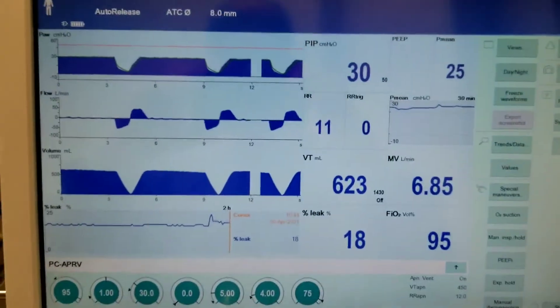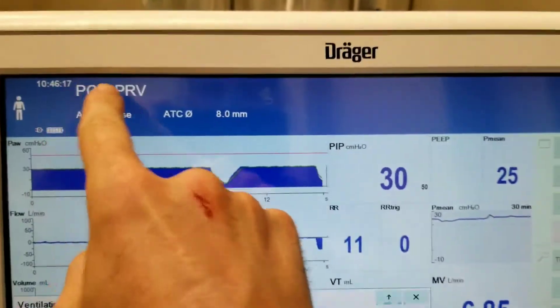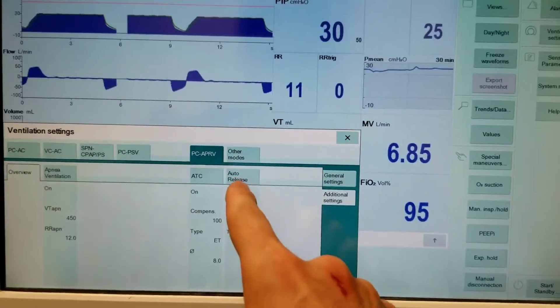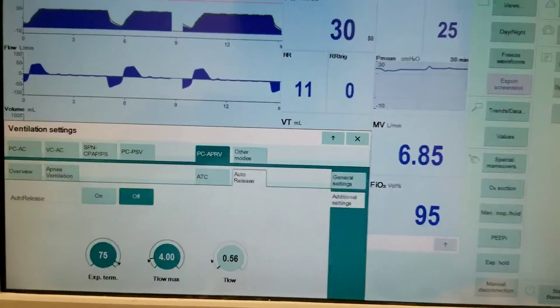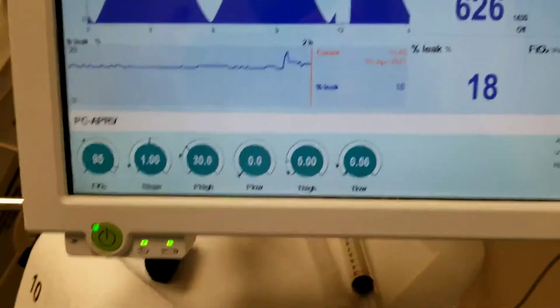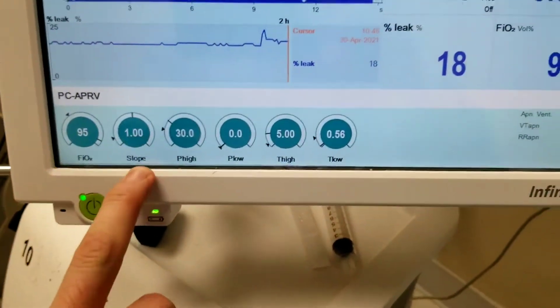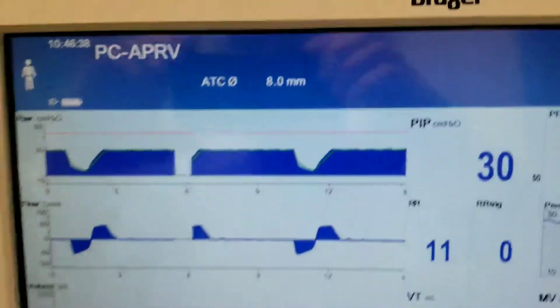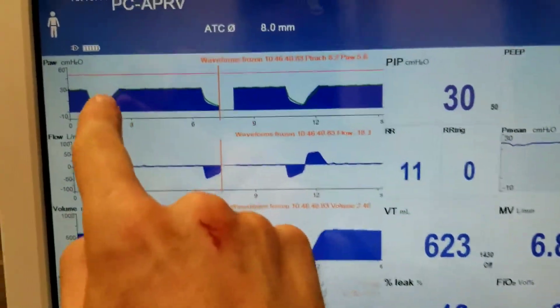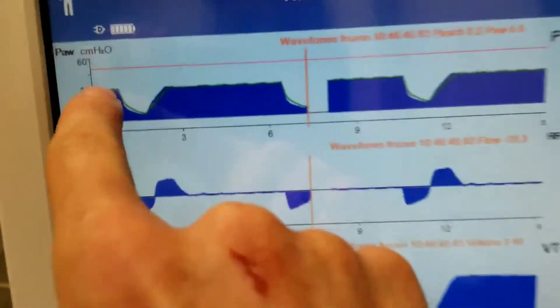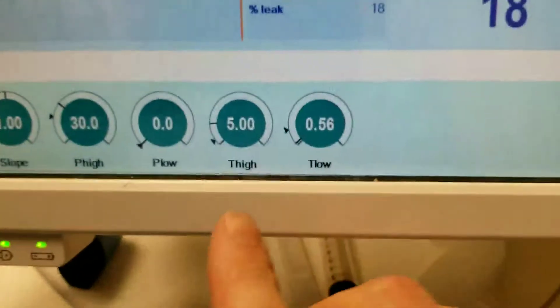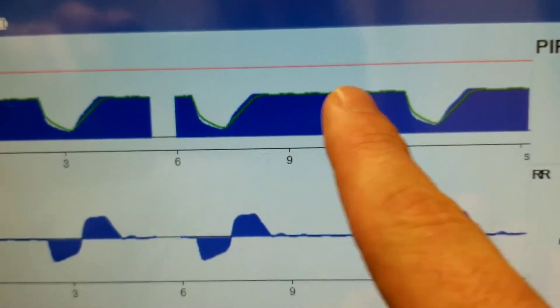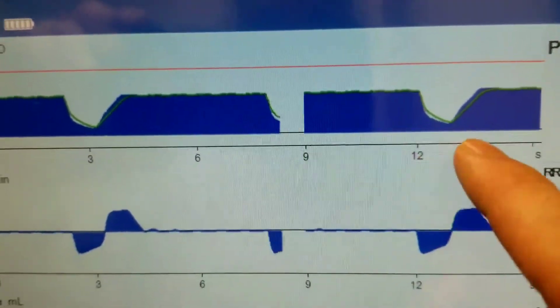This is the APRV setup, specifically with PC-APRV. Starting with the traditional way of using APRV: on APRV you're going to have your oxygenation, a slope, a P-high, a P-low, a T-high, and a T-low. P-high is set at 30 — this is the level of 30 that you see here — and we're telling it to stay like that for 5 seconds. So your P-high is set at 30, stays elevated for 5 seconds, and then it drops.